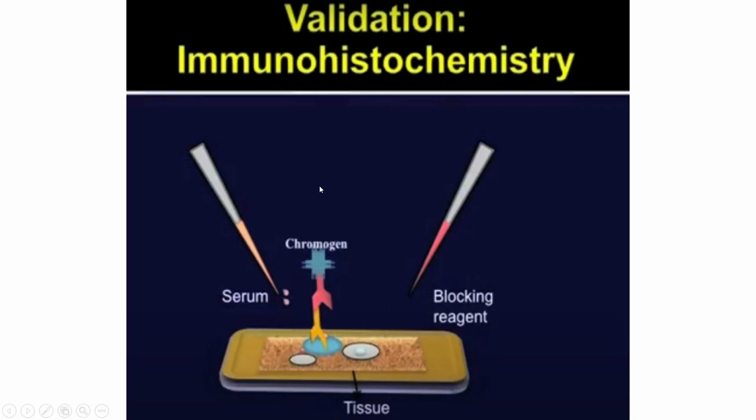There is another technique called immunohistochemistry, wherein a tissue sample is used, and if the tissue is expressing a specific protein, then when you add the serum that has the specific antibody, and then the secondary antibody tagged with a certain enzyme, and add a substrate like a chromogenic or chemiluminescent substrate, you can visualize whether your protein of interest is present in the tissue sample. Or else, if there is no protein in the tissue, you won't be able to see that interaction and it cannot be visualized.